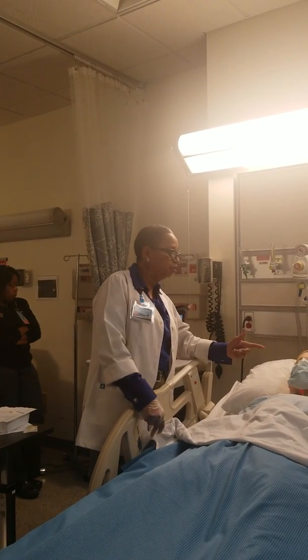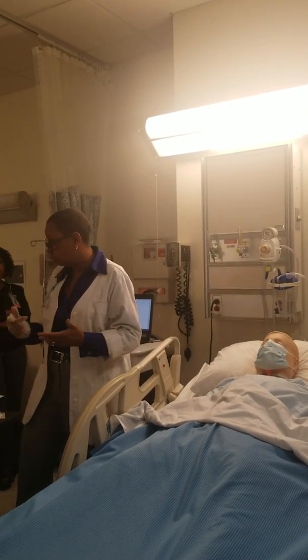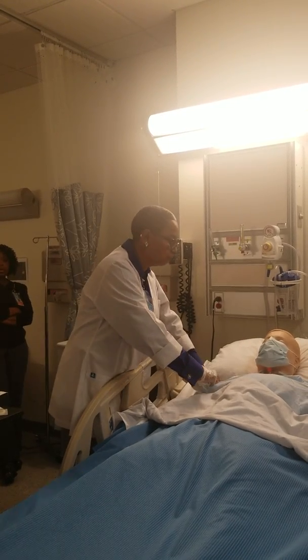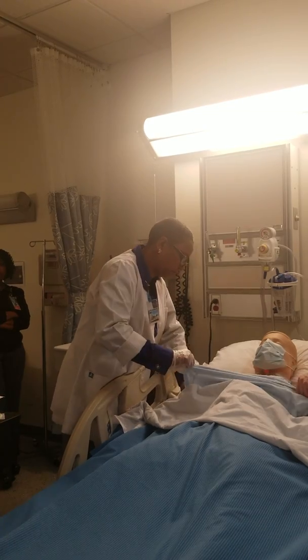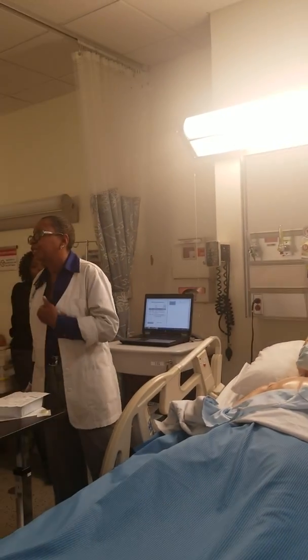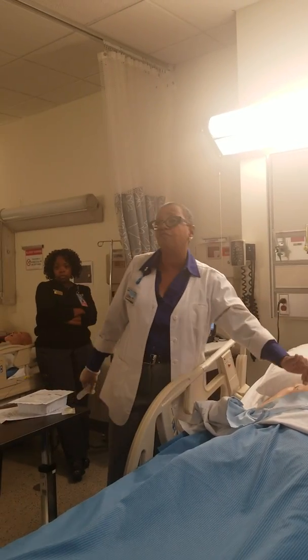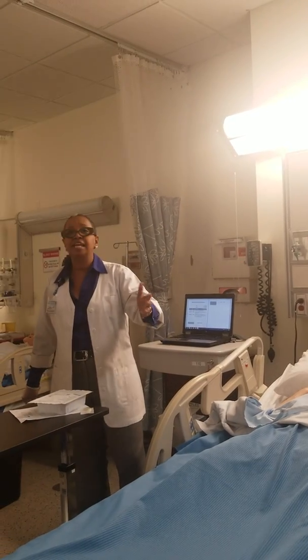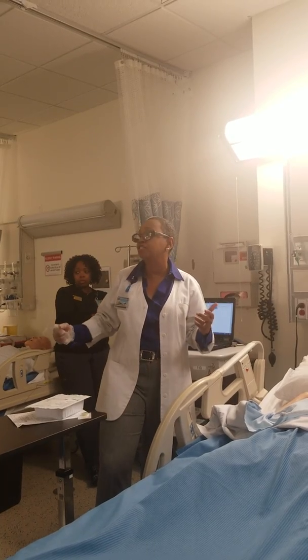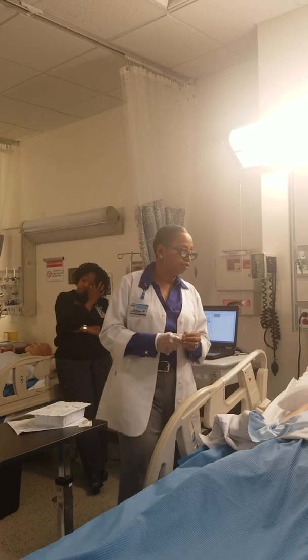Another thing you're doing by putting the mask on him is so that he won't cough into his own sterile field, because he can do that once I expose him. And if you have somebody with a wound, make sure you have that person turn their head to cough, because otherwise they're coughing right into their wound. And that's how you get infection from what? Your normal flora, what's in your mouth. That's how burn patients get infected. They infect themselves, they're infectious to their own selves.